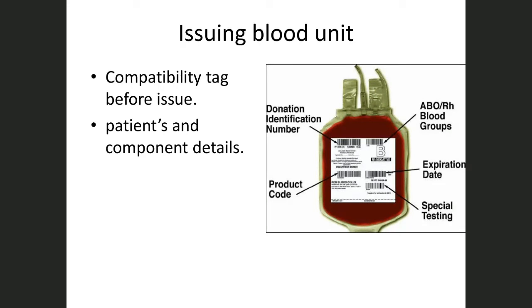So when we choose a compatible unit, we decide that this patient needs B negative. We open the inventory, and as we said, we choose the compatible unit, then do cross matching. If it's homogeneous, that means it's good, so we choose this for this patient. Negative.